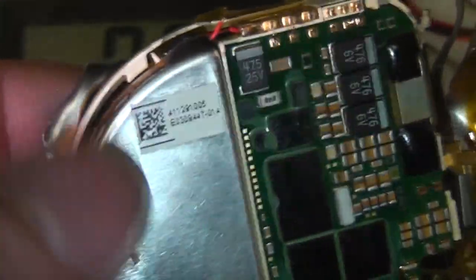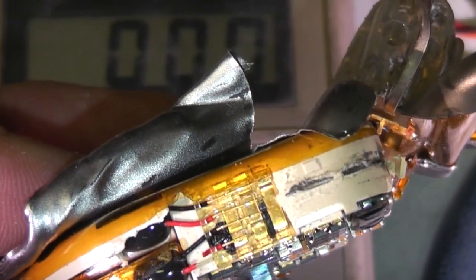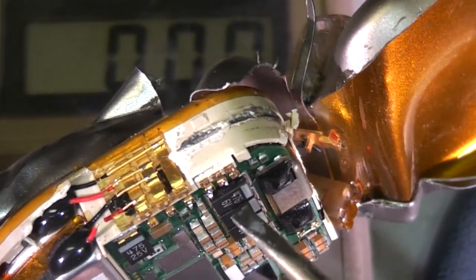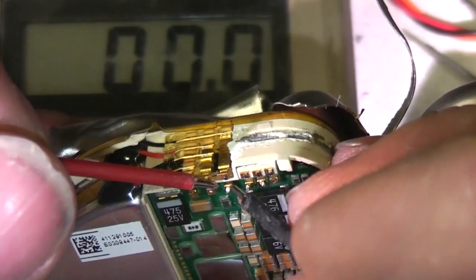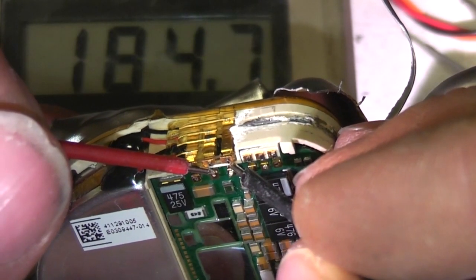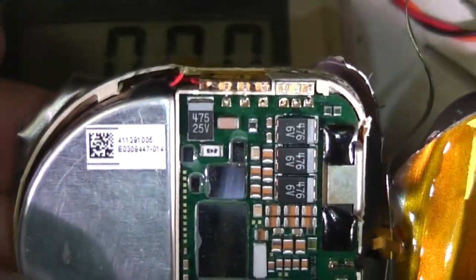Right, I think these two large things at the bottom are actually the high voltage capacitors rather than the battery. There's no voltage measured across them, but I was measuring 2 volts across these two terminals here. Just measure these. Yeah, I measure about 185 microfarads. Not sure what voltage these run at.